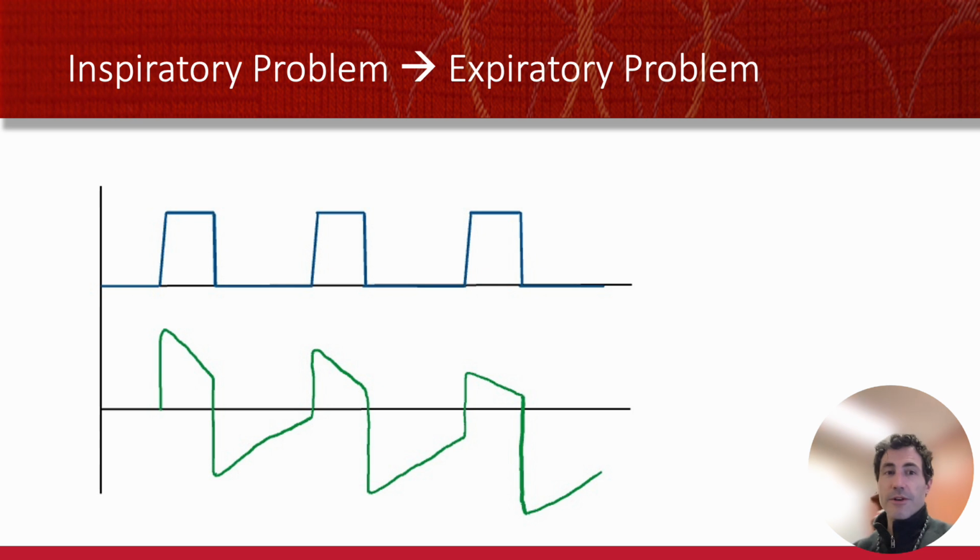And what we see here is where the patient has a fixed pressure, and another pressure breath. But at the bottom, they breathe in normal. They don't breathe out all the way. And they breathe in again, but if their lungs are partway filled, that breath is a little smaller. And here it gets bigger and bigger, because as you keep air trapping, if you set the respiratory rate too fast, it will keep happening.